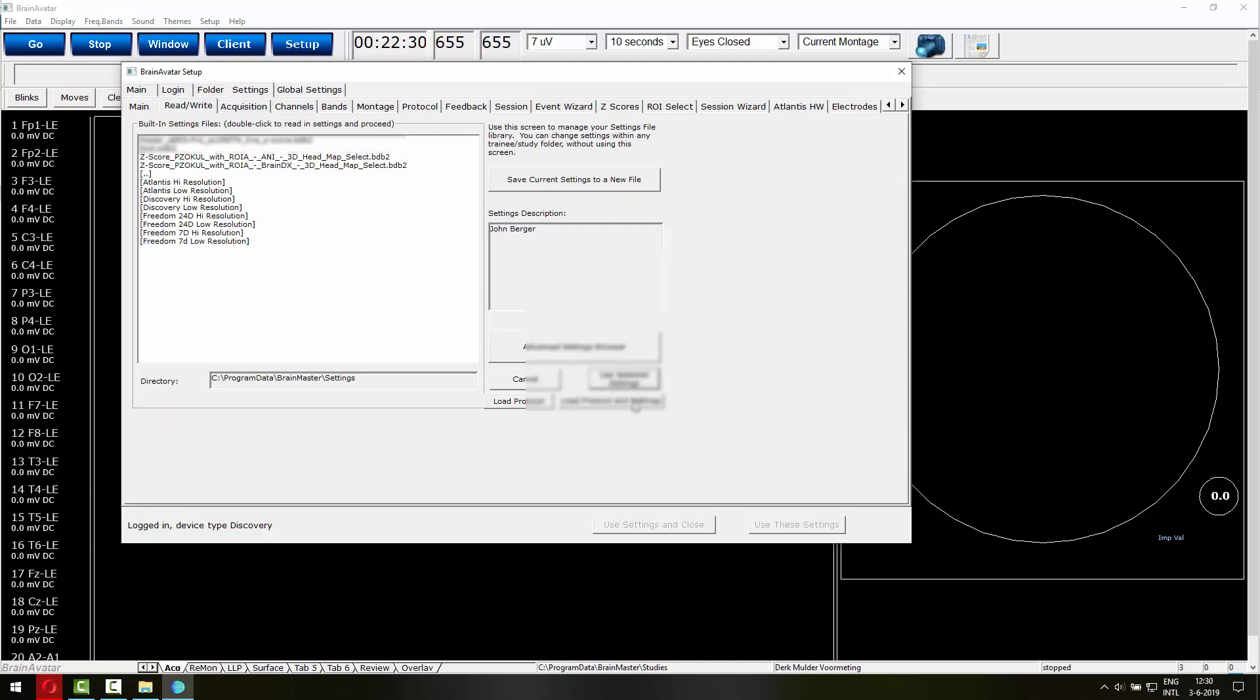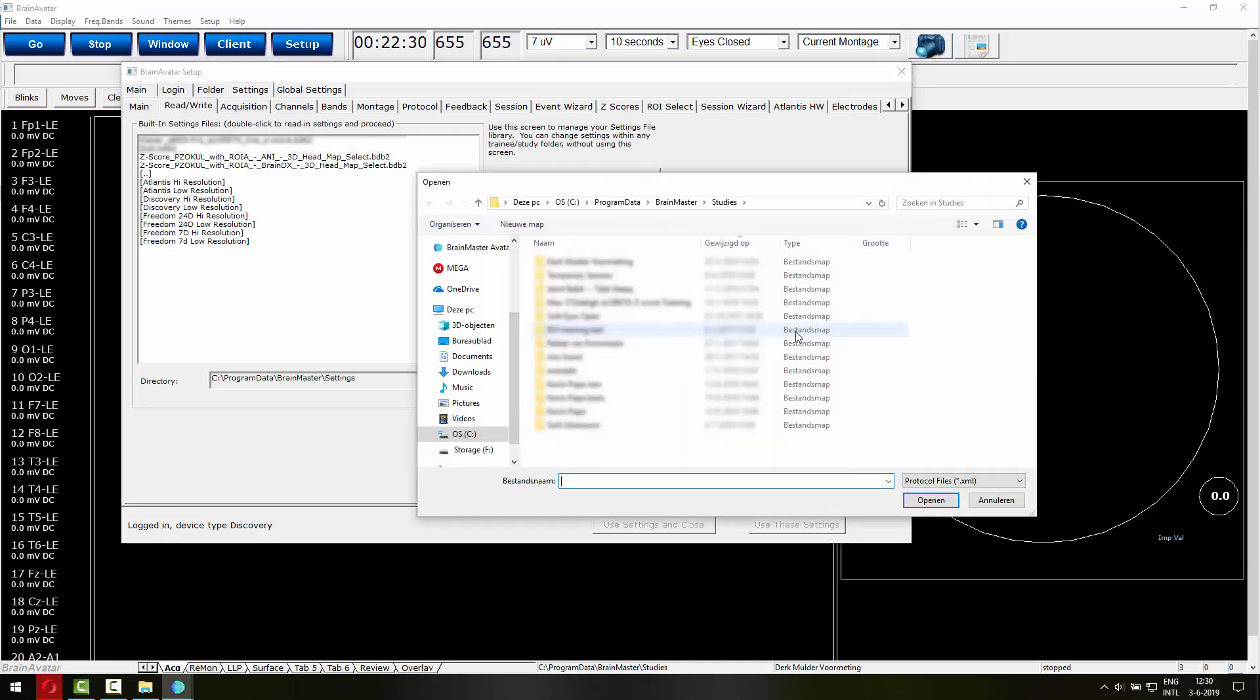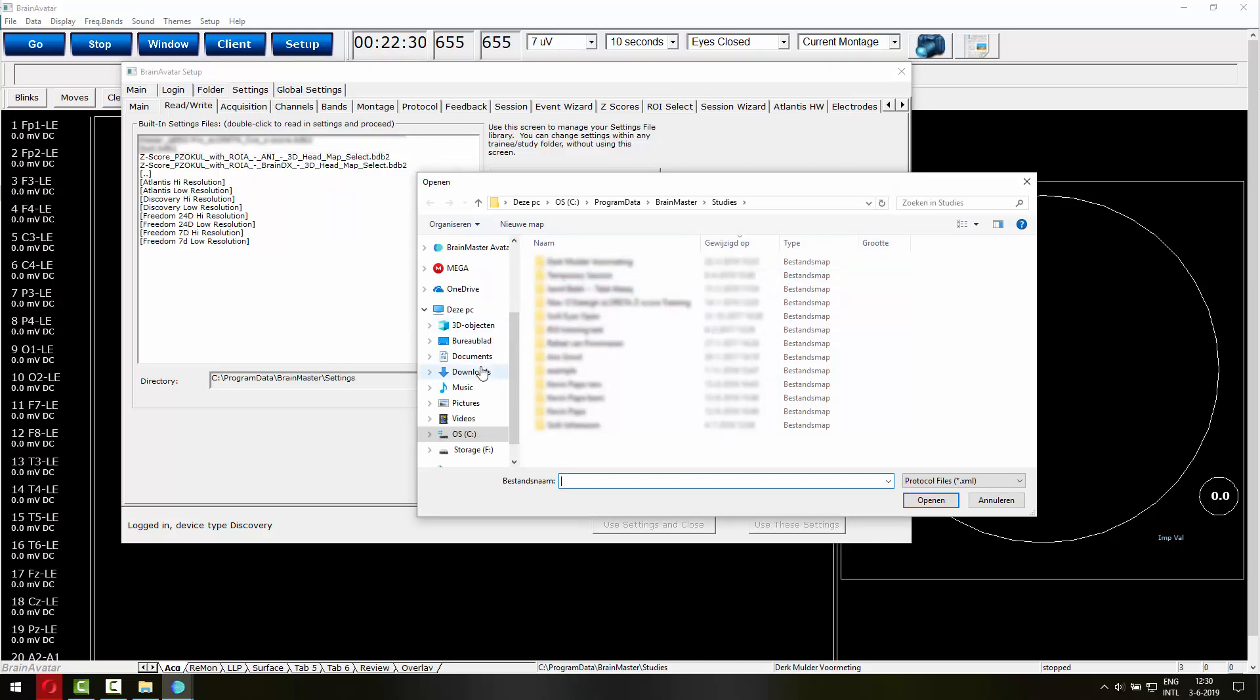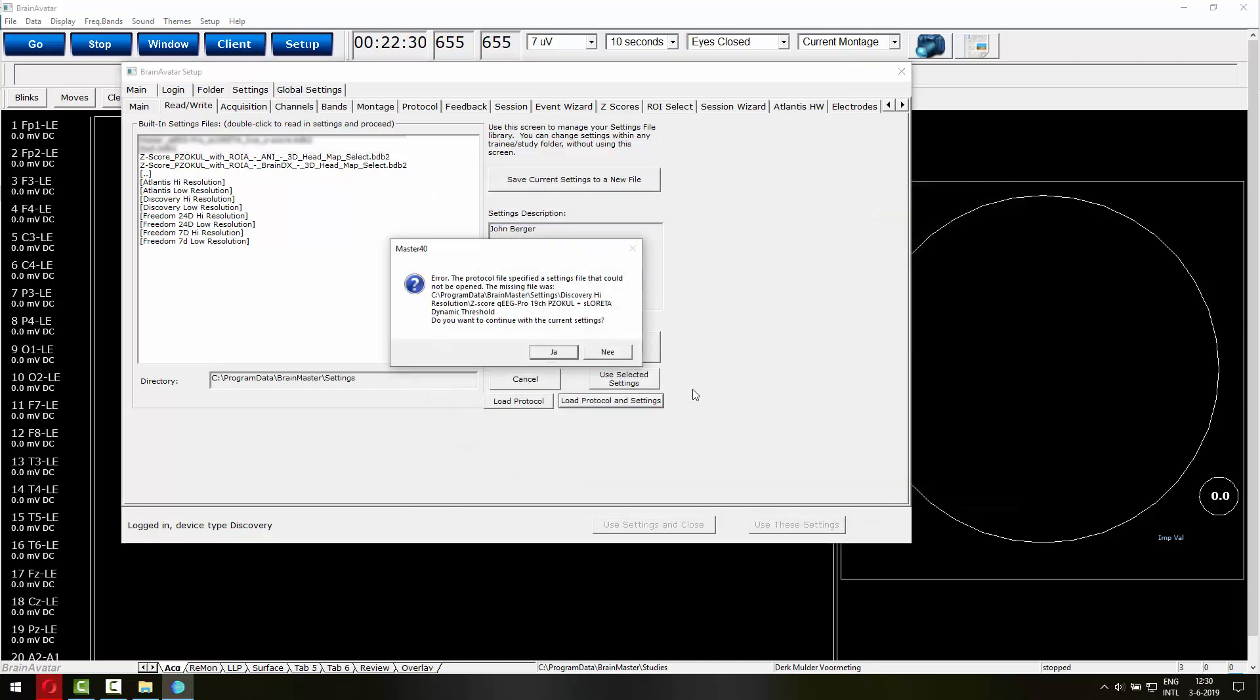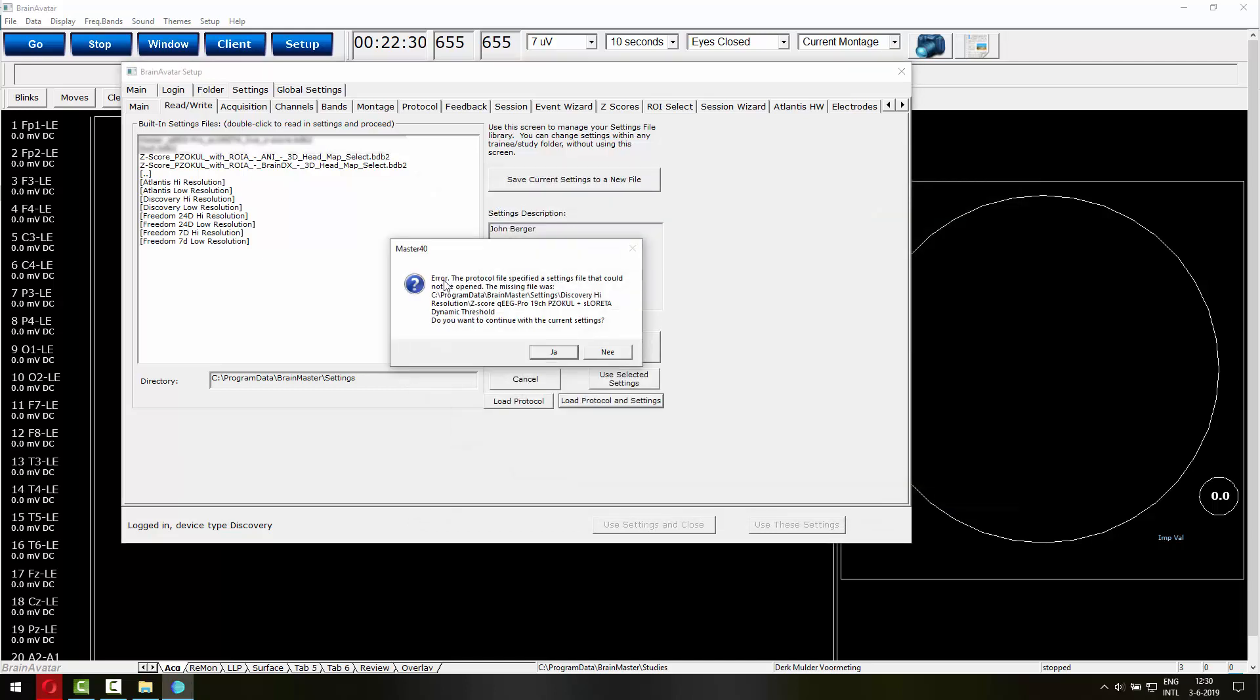So if I click that button, I have the option to select an XML file. So this is the one we just downloaded. Let's open it up. It will give you an error file which can be ignored.